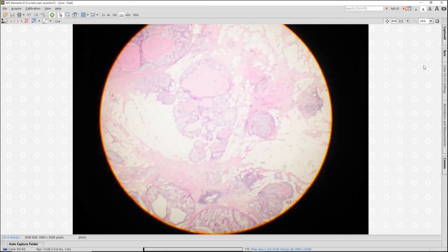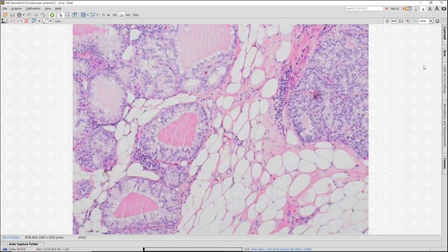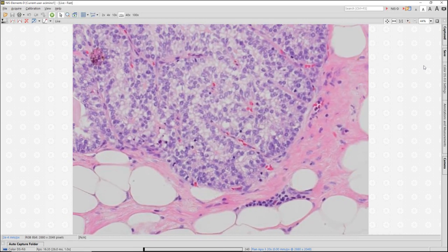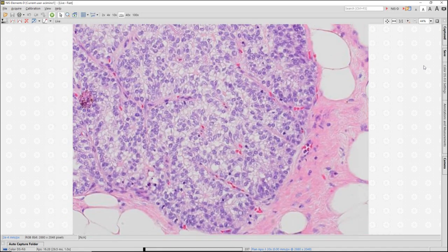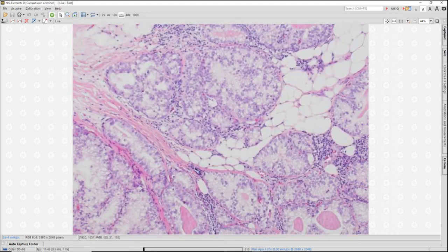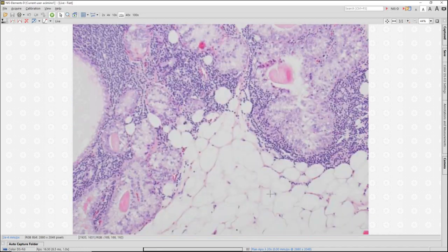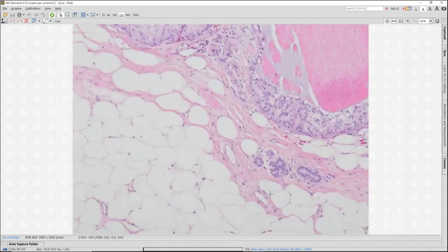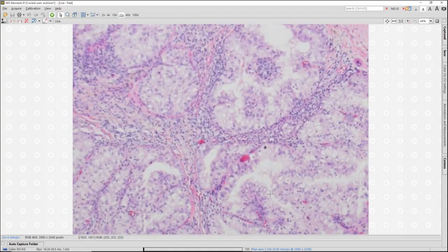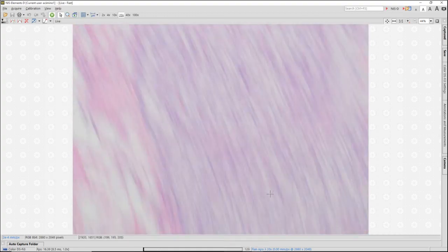Okay. So in this particular case, we see a lesion that shows papillary architecture by the presence of these fibrovascular cores, but they're in irregular nests of cells that have, in this case, intermediate nuclear grade. In some cases, we'll see higher nuclear grade, with irregularly shaped infiltrative nests, sometimes with a desmoplastic response, that go into the stroma.